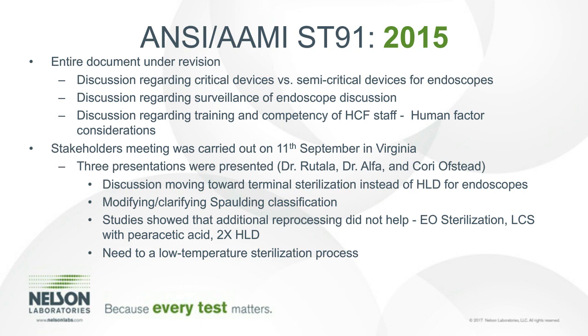Studies showed that additional reprocessing did not help. Ethylene oxide sterilization is not the answer all the time. Liquid chemical sterilization is difficult to perform in healthcare facilities and monitor. And performing high-level disinfection twice hasn't shown any benefit either. They have proposed to the industry and to the standard committee to promote a new low-temperature sterilization process for these type of devices, as they believe that they should be sterile and not high-level disinfected.